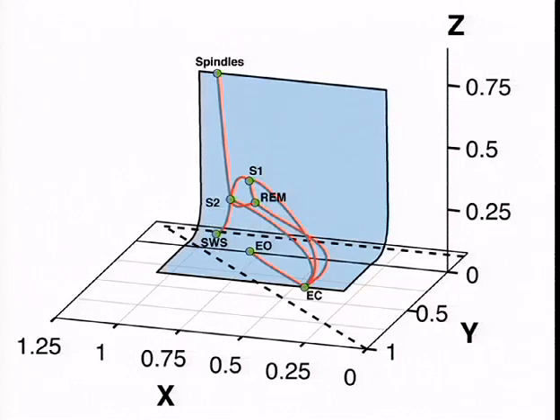So in terms of understanding seizures then, I want to focus on just one transition, which is from sleep state, as an example, from sleep stage 2 to wake with eyes closed. And I want to ask two questions. The first one is, can we reproduce this trajectory by integration of the nonlinear equations? Because this trajectory is produced using the linearized version of the model, which is fine for the healthy brain states, but not for the seizures, or not for understanding the dynamics during a seizure.